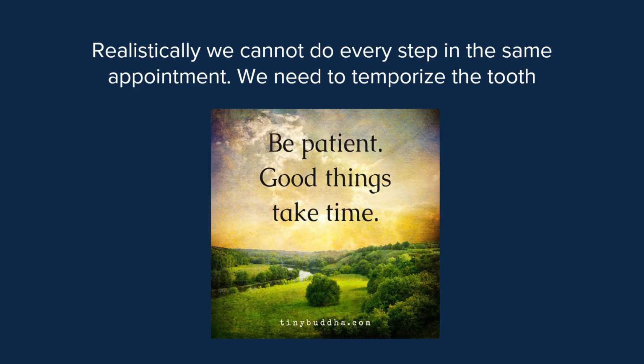Okay, so we've gone through all the steps. But realistically, we can't do every step in the same appointment. We need to temporize the tooth. Again, never say never, never say always. There are some cases where you can do all those steps that I just went through in the one appointment. An example is if a kid or anybody breaks their front tooth and the nerve's exposed, then we're going to clean out the nerve, rinse it, and because we know it's pretty clean on the inside, we can put our rubber plug in quite comfortably and then build up their tooth for them. But be patient. Good things take time.